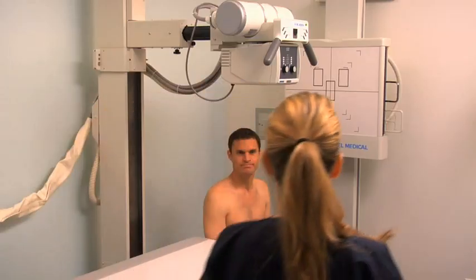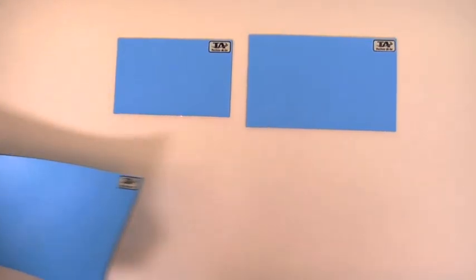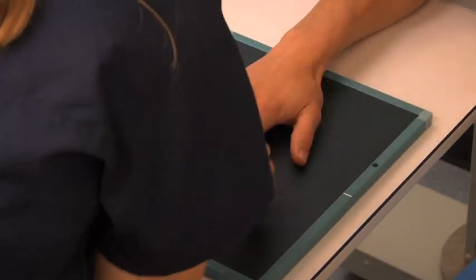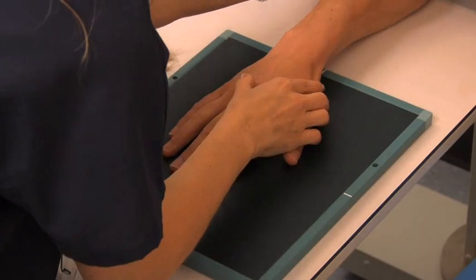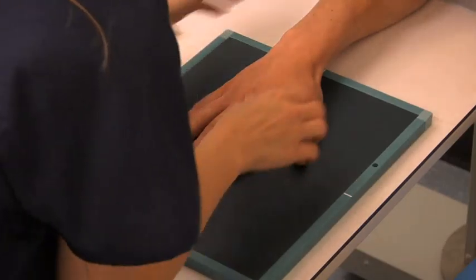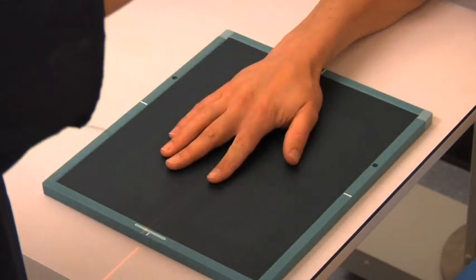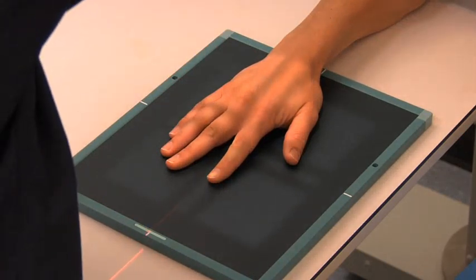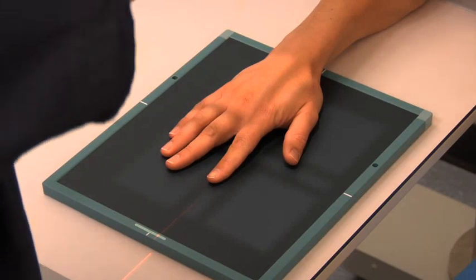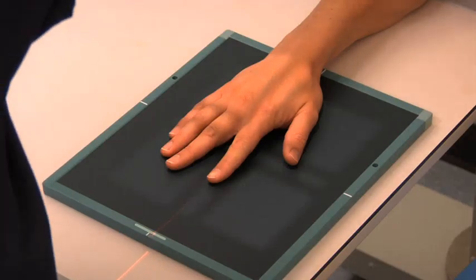Ask the patient to sit alongside the end of the table and position the protective lead shield over the patient's reproductive organs. Assist the patient to flex their elbow to an angle of 90 degrees, supporting their elbow, forearm, and hand on the tabletop. Place their hand palm-side down on the surface of the cassette. Center and align their second finger with the cassette, separating the adjoining fingers so that the soft tissues are not superimposed. Align the central ray to the proximal interphalangeal joint of the same finger.